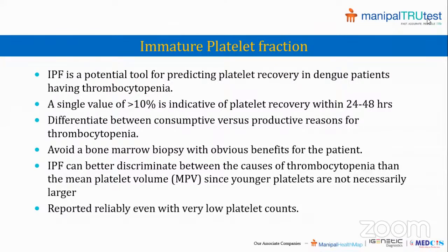And this fraction works very well even with a very low platelet count. Even if it is less than 20,000, the IPF is very useful in determining the platelet recovery.